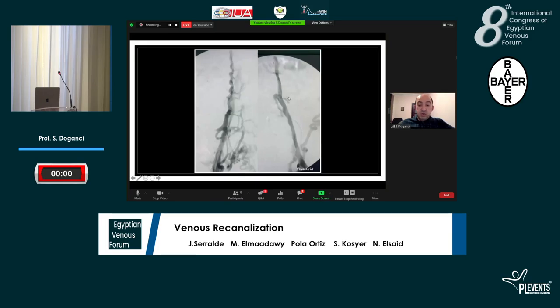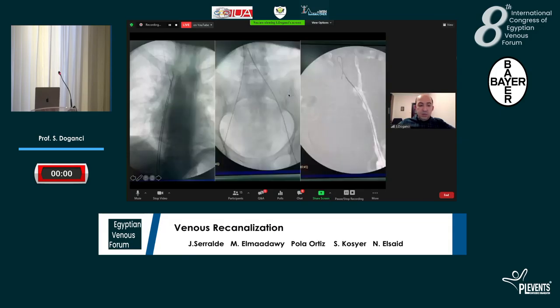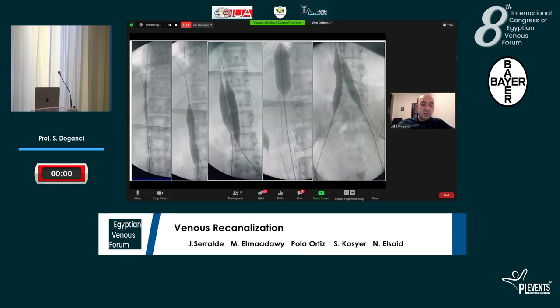All we see are the ascending lumbar collateral veins, and sometimes it is a bit difficult to cross those lesions. If you are lucky and you cross these lesions, especially for caval stenting, I always advise to park your wires above the heart, because in case of any stent jumping, if your wires are still there, you have a chance to get it back. So always park your wires above the heart. Then we start with small balloons, and then you go to bigger balloons.